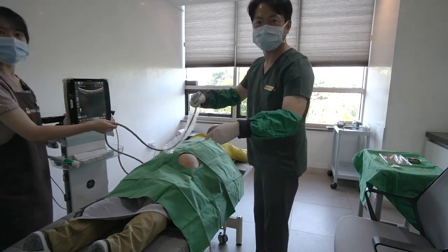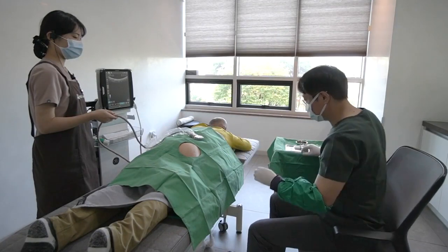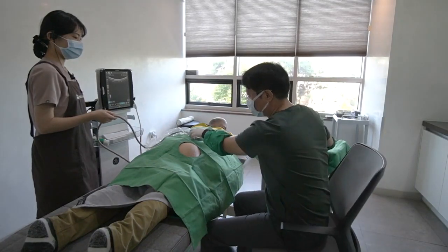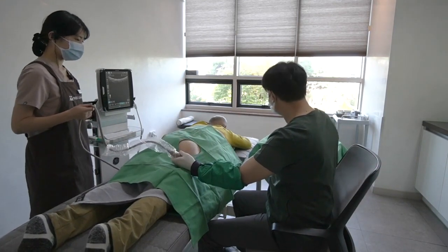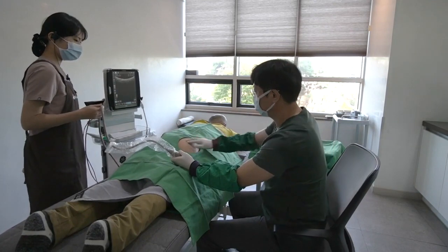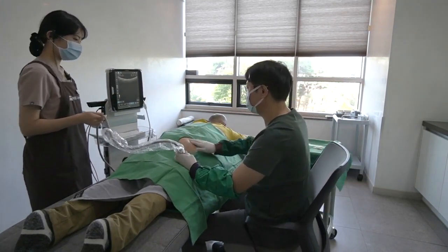Please ensure the patient's position. The patient is prone, directing the face to the window side and exposing the gluteal region to the procedure side. My first target is the piriformis muscle, the second target is the lateral side of the ischial tuberosity, and the third is the quadratus femoris.